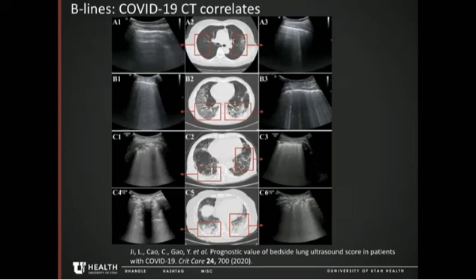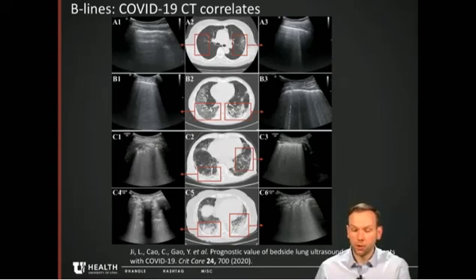These are more advanced findings and maybe a little bit out of the scope of the average practice of an anesthesiologist, but I think it indicates how we think about B lines and how there's a spectrum, and I think that's important to consider when you're comparing different patients or even different regions of the lung that you're looking at on the same patient to get a sense in your head of what these CT scans might look like, since these artifacts that we're looking at are not really anatomical or intuitive in terms of our understanding.